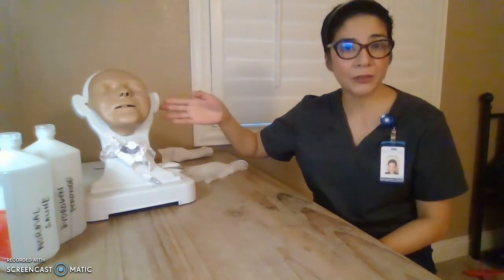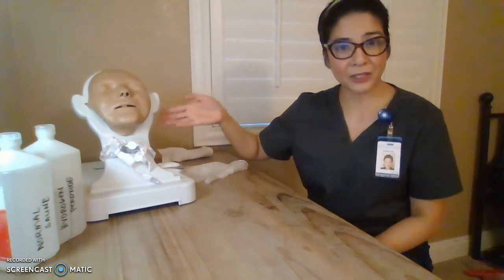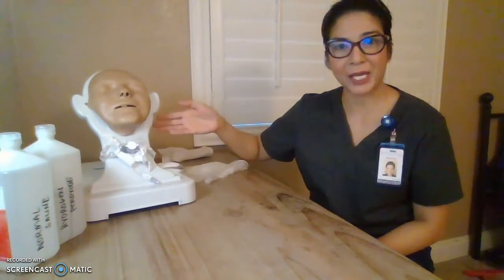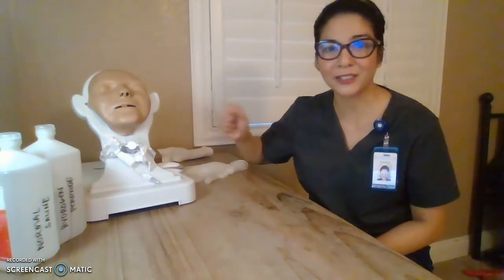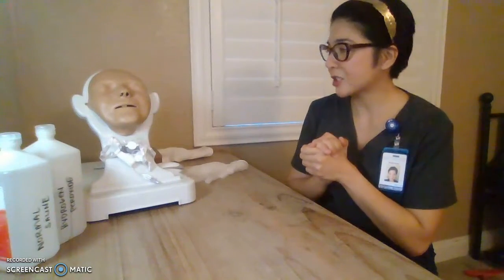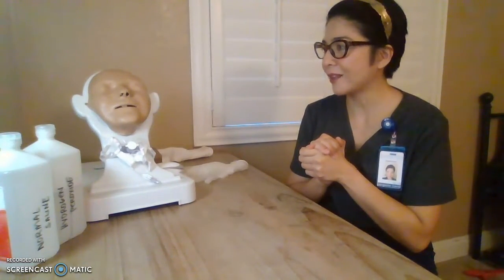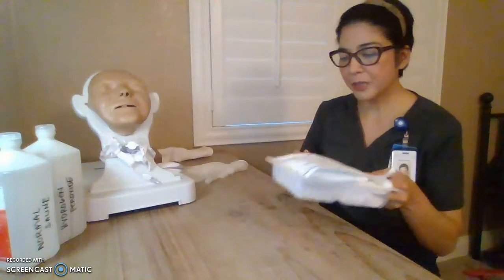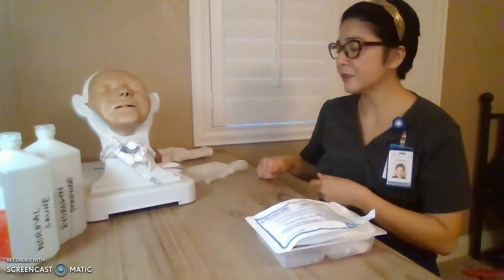And at this moment, if the patient needs any suctioning, it's a good time to do that. After suctioning, remember to reoxygenate the patient as needed, depending on his condition. All right. So, Mr. Smith, I'll be coming back. Let me just gather my supplies. Is that okay? Thank you. Hand hygiene out of the room. Gather your supplies. Coming in.